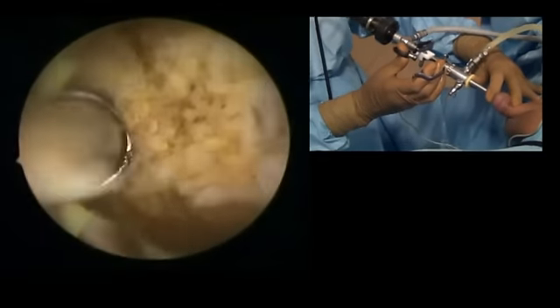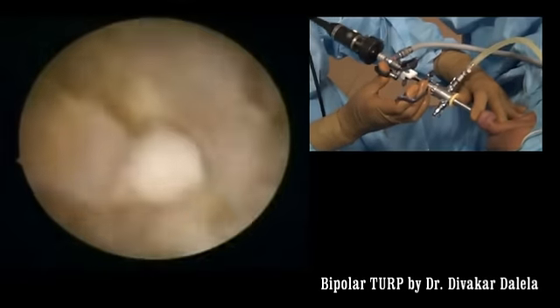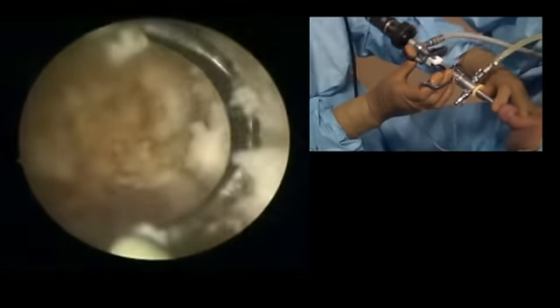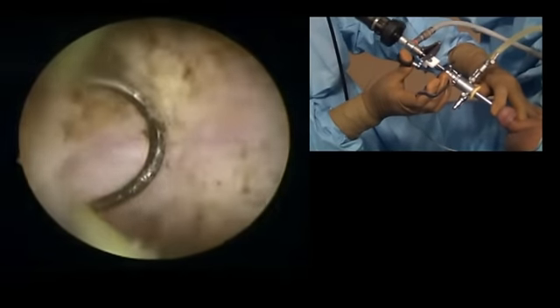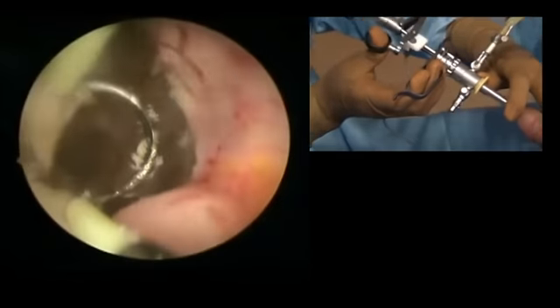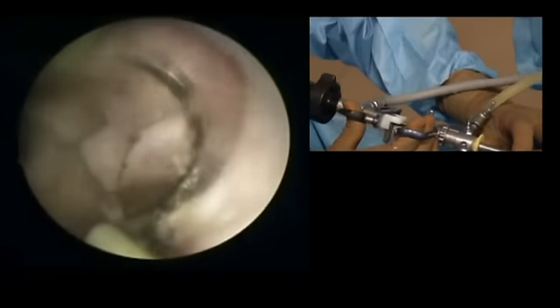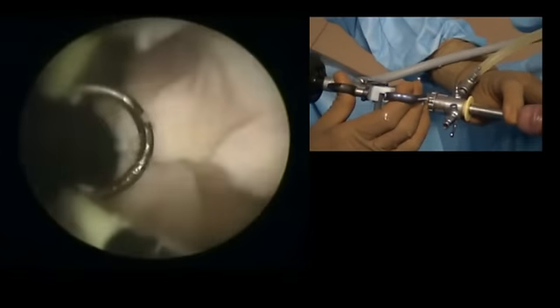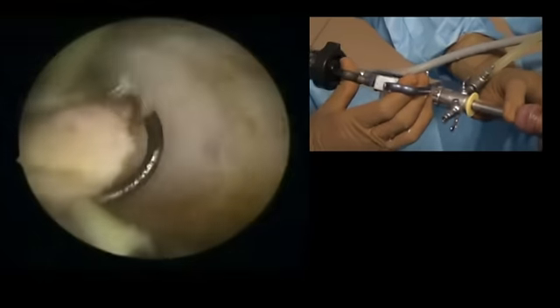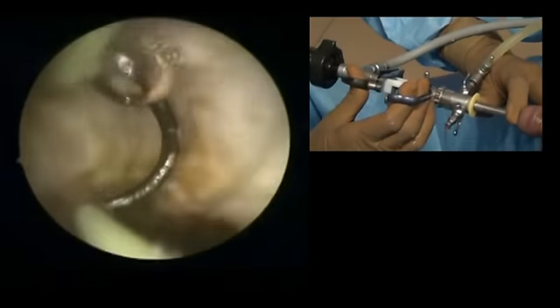Again I am shaving a little bit — I don't expect much tissue here either. This is now close to the capsule. Anterolaterally on the left side, this area is also close to the capsule.